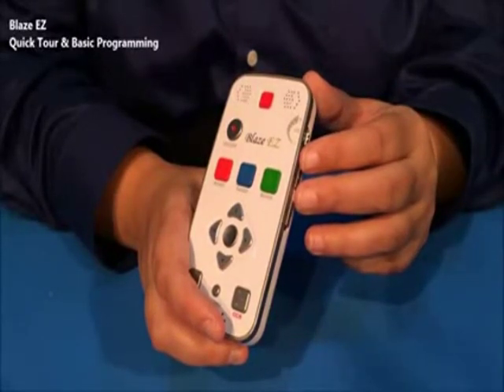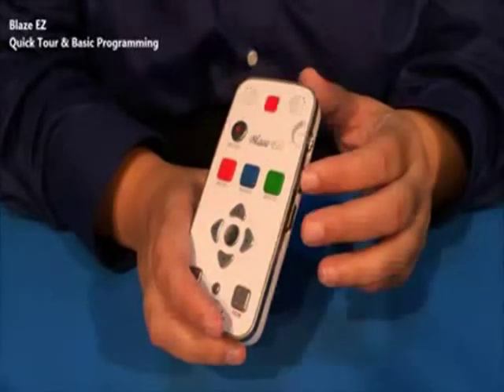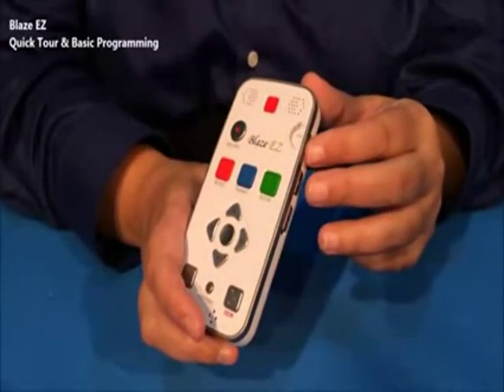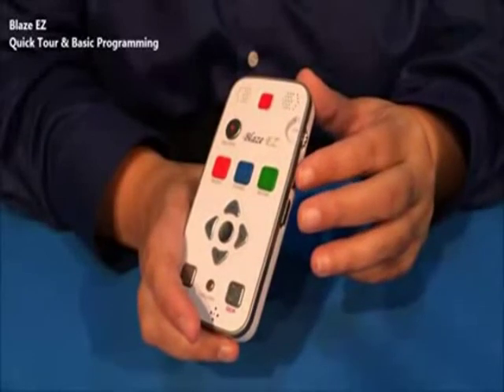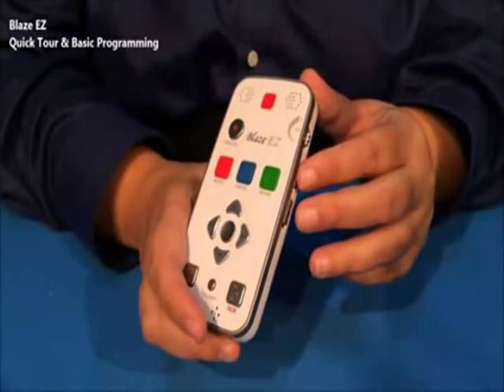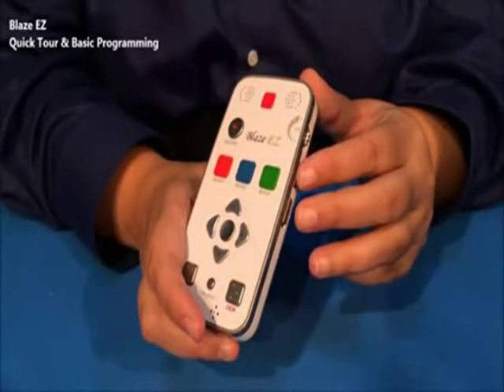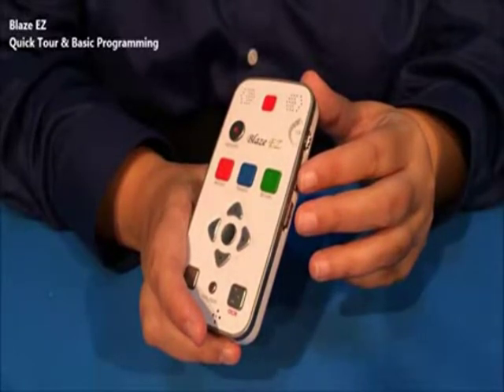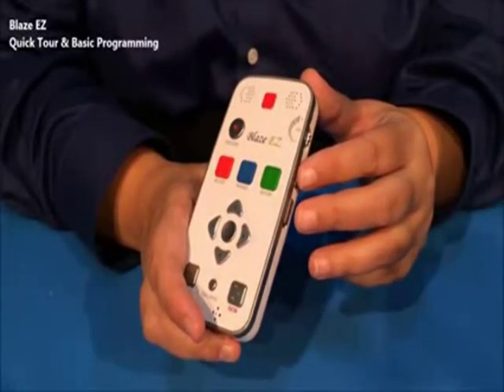So now if I press the voice control button, Guide voice speed 11. I can adjust the guide voice speed, Guide voice pitch 5. The guide voice pitch, Guide voice volume 15. And the guide voice volume. Because I am in the main menu, these are the options that I have. Again, as I previously explained, if I was playing media or something else, I would actually be able to adjust media rate, media preamp, and such, and media volume.